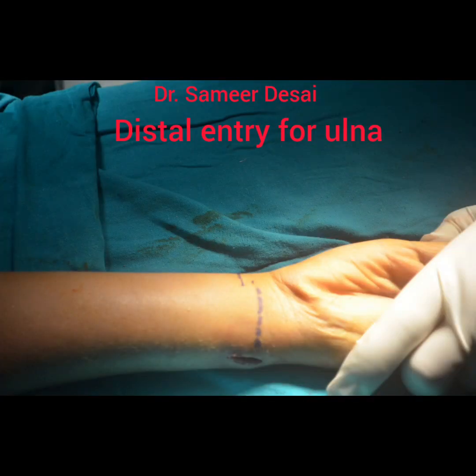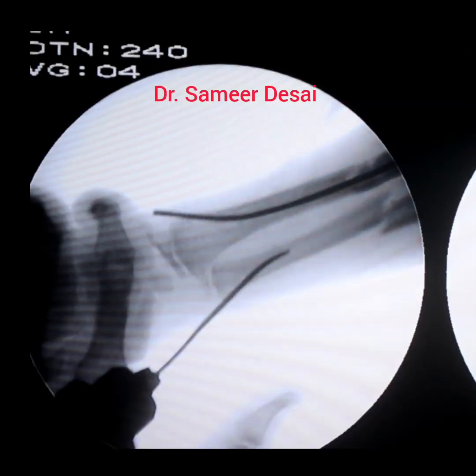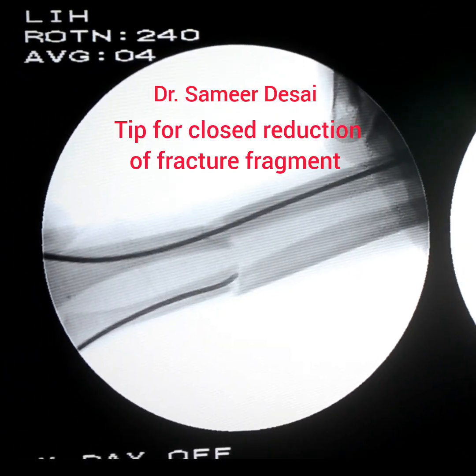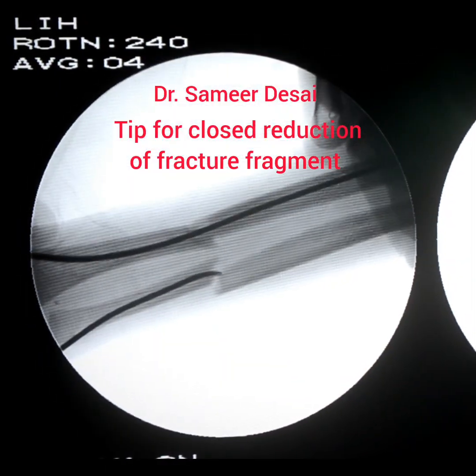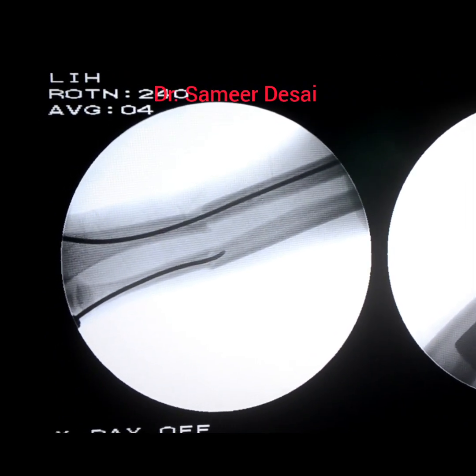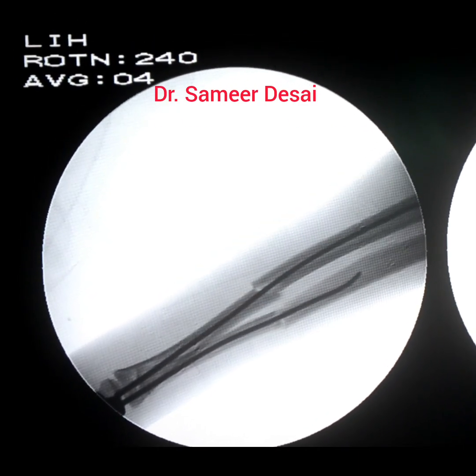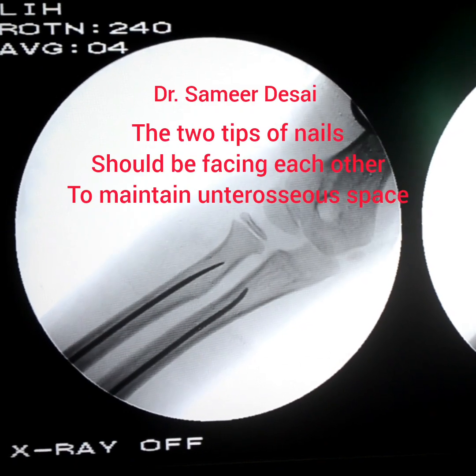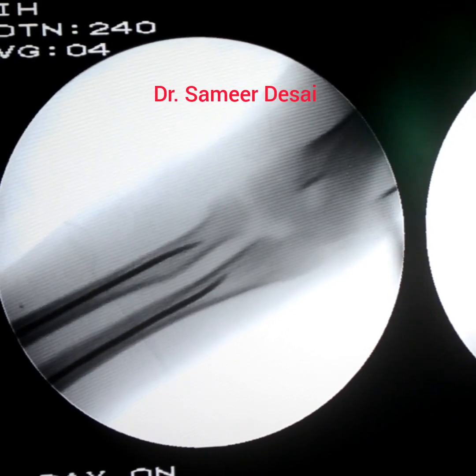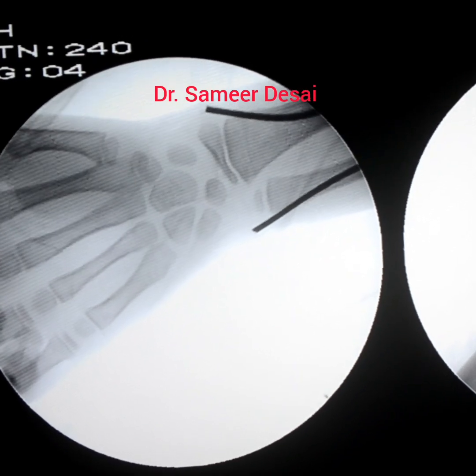Over here we are going to use the distal entry for the ulna. We are now going to demonstrate how to reduce the fracture. Advance the nail, rotate the nail towards the proximal fragment, enter the proximal fragment, and then rotate the nail again so as to reduce the fracture fragment. Advance the nail in such a fashion that the tips of the nail should be facing each other to maintain the interosseous space. This is the final picture.